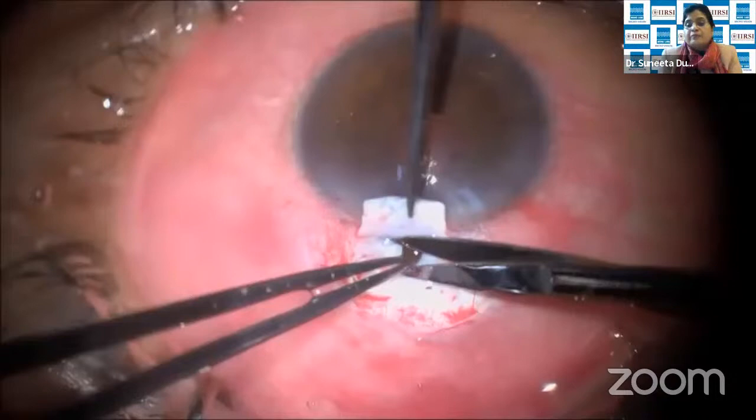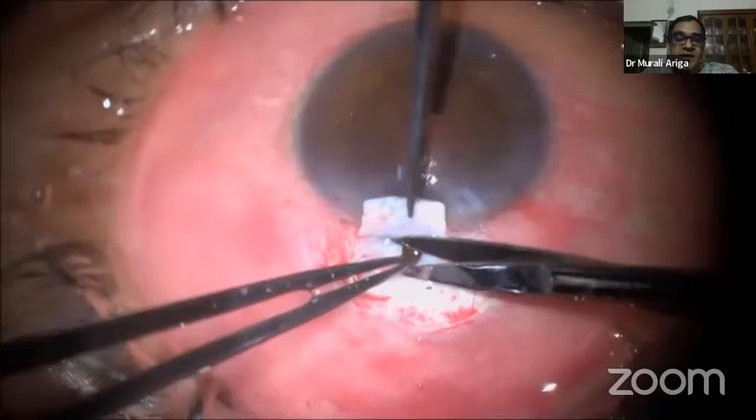Pierce Hoskins. I think Pierce Hoskins forceps is the best. Pierce is the best. Pierce Hoskins is perfect. You see the placement of the vannas and the direction, an exact perpendicular cut to the limbus. I think this is the way the iris should be cut.